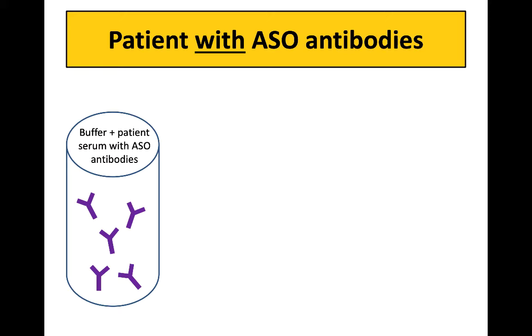So in this situation, we are asking ourselves: number one, has this patient ever been exposed? Are they currently exposed? Do they have a really high titer? Or have they been exposed recently and they're coming down? So that's what we're setting the stage as.